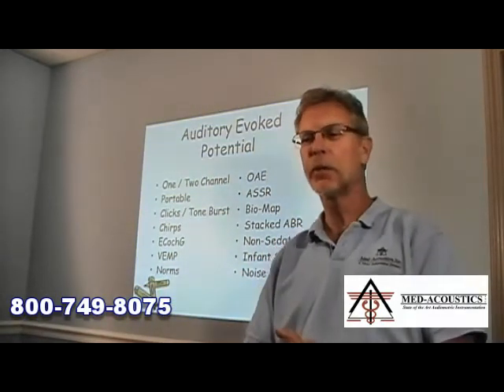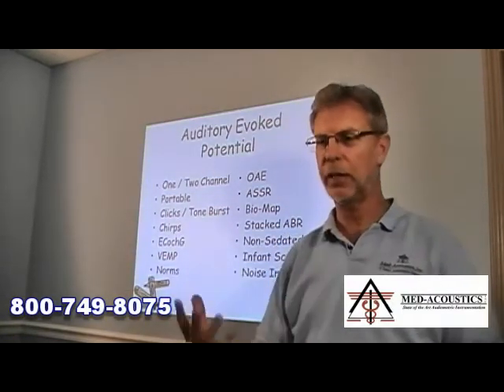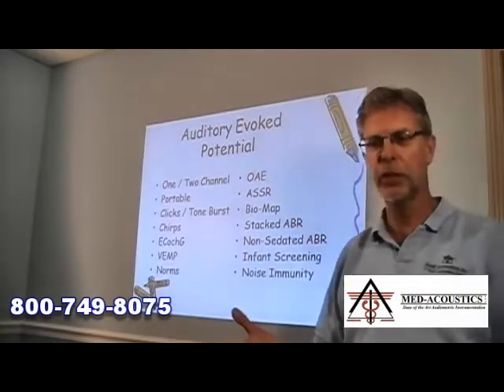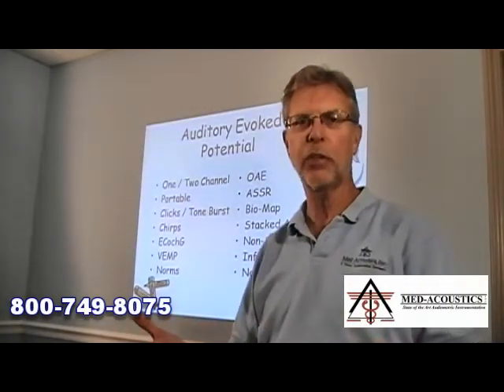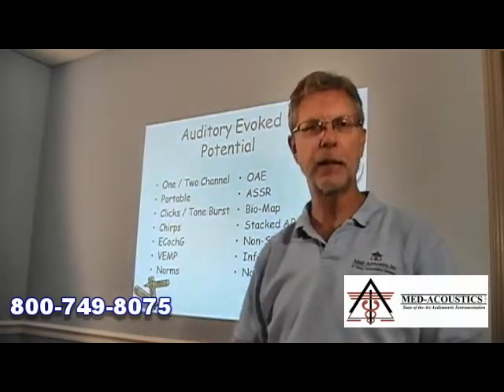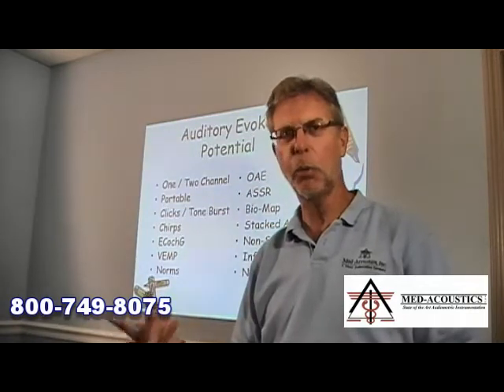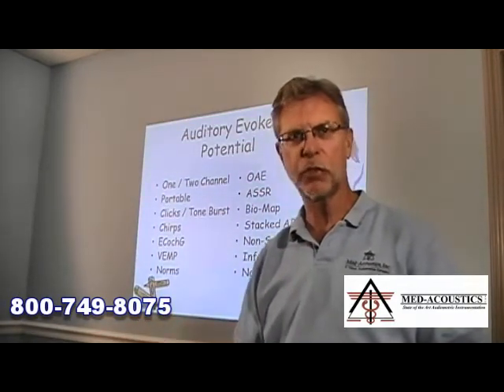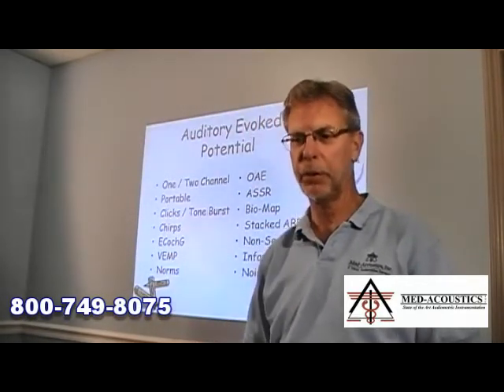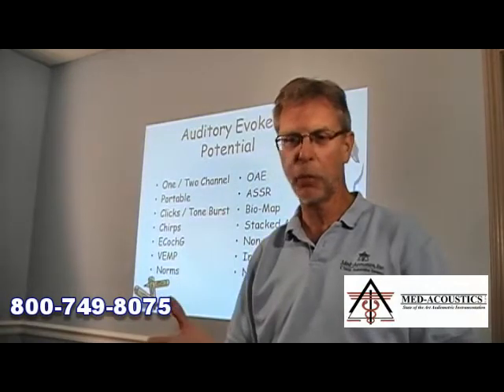Okay. Well, the first thing that one has to decide are the questions on this slide. Do we want a 1 or 2 channel unit? That's important because there are systems out there that are limited to 1 channel. And if having the second channel is important to us, then that would eliminate those. Does it have to be portable? Essentially all systems today are portable because they are relatively physically small footprint, and will run on a laptop computer. But some are a little more portable than others, so that might be a consideration, though they're all portable.